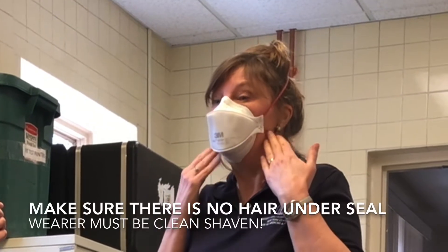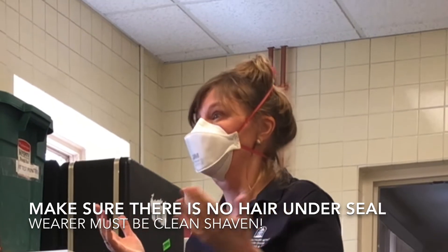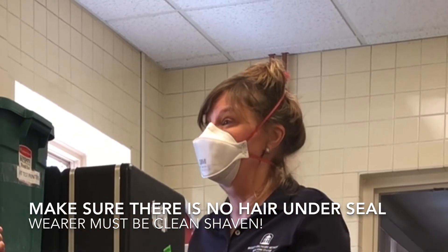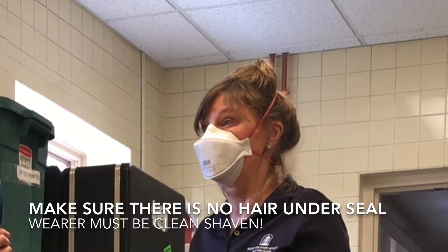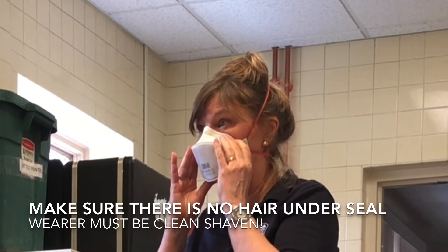That's why you don't want any hair underneath that place where the seal is. For gentlemen, they need to be completely clean shaven or it won't give them the protection that they need. One little hair under here can keep you from having that perfect seal.